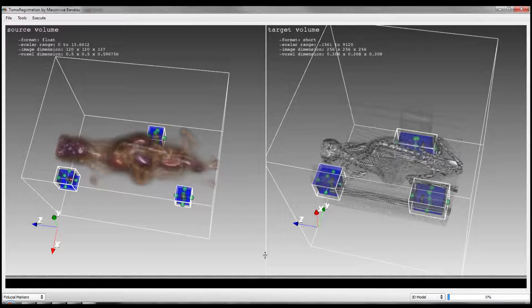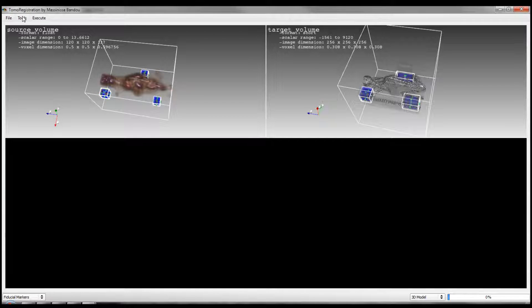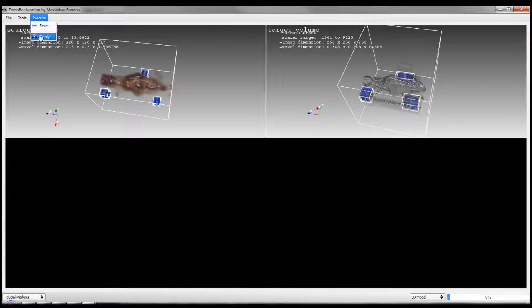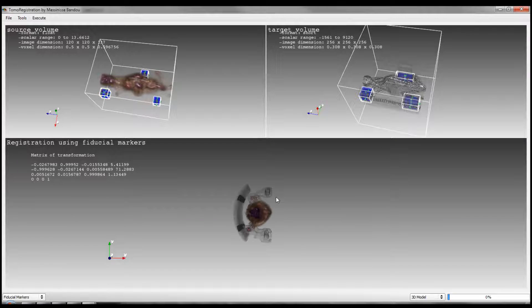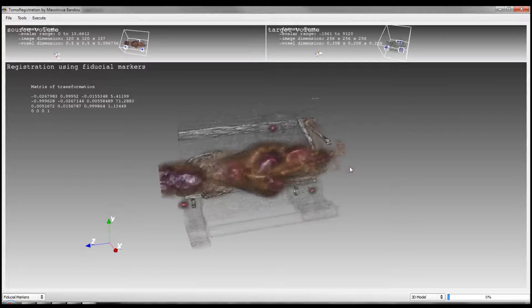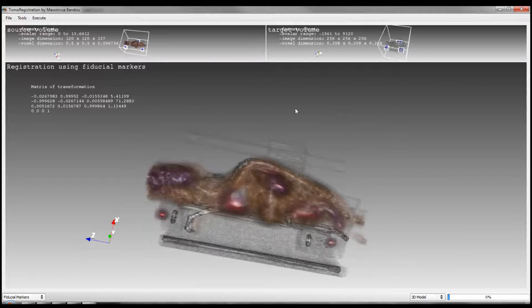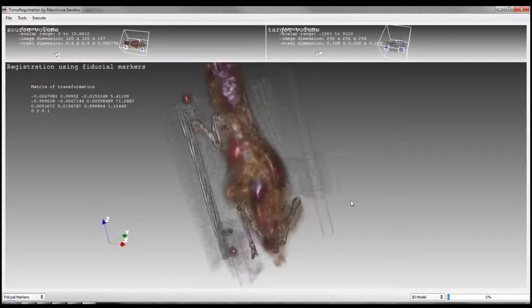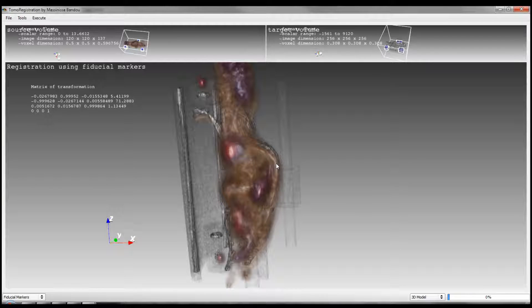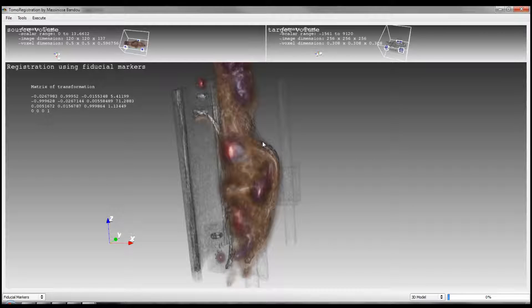Now we can perform the registration. By selecting settings, because we want to perform registration only with fiducial markers without any additional algorithms, we press Apply. This is the result — it seems correct at first view. But if you zoom in, you will see some misalignment on the vertebral column, as you can see. There are some differences in the CT image here. So we need another algorithm to fine-tune the results. I suggest choosing the mutual information algorithm based on voxel intensities.